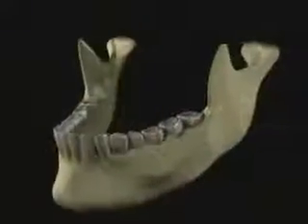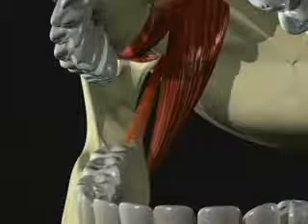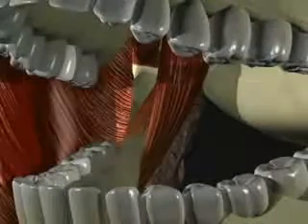The primary goal of all of the mandibular blocks is anesthesia of the inferior alveolar nerve, which innervates the pulps of the mandibular teeth on that side, as well as the buccal periodontium anterior to the first molar. For each of the three techniques we'll describe, this goal is accomplished by depositing anesthetic within the pterygomandibular space. This space is bounded laterally by the ramus of the mandible, medially and inferiorly by the medial pterygoid muscle, superiorly by the lateral pterygoid muscle, posteriorly by the parotid gland, and anteriorly by the thin buccinator muscle.